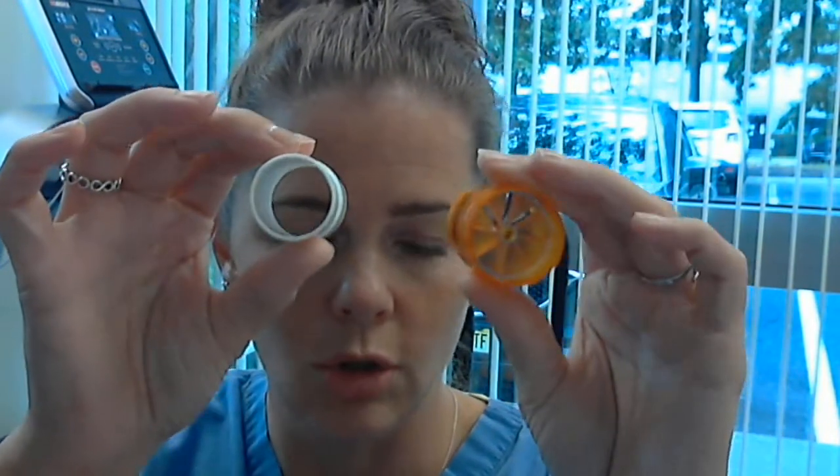So what you're going to do with these two things: you're going to soak them only in hydrogen peroxide for 30 minutes. Then you're going to take them out of the hydrogen peroxide and soak them in sterile water for 30 minutes. To make sterile water, you boil tap water for 5 minutes, let it cool, and that is sterile water.